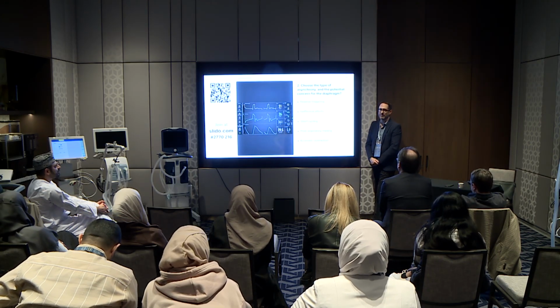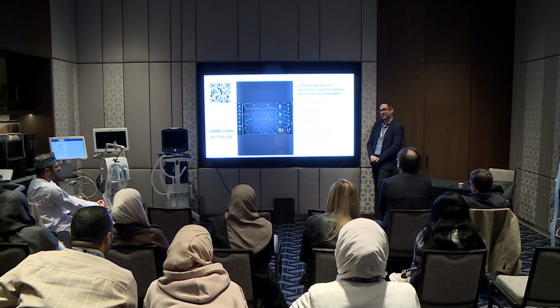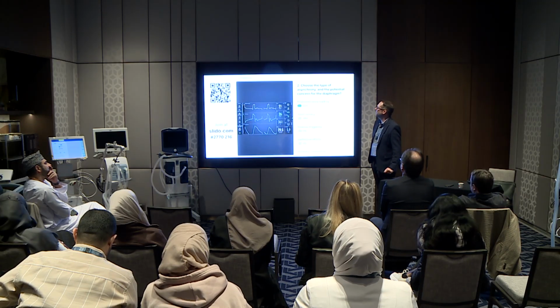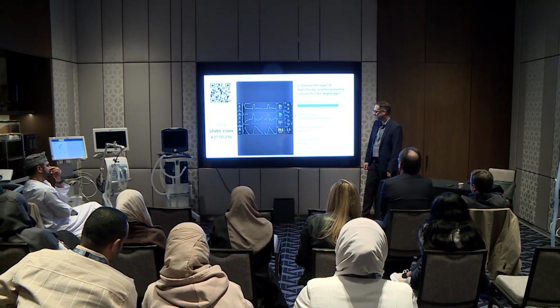If someone chooses reverse triggering, I know that it's way too late in the day and they're tired, because I just told you it's not reverse triggering. One more vote. Someone's going to do it now just to be funny. Okay, here we go. Post-inspiratory loading and short cycling, very good.